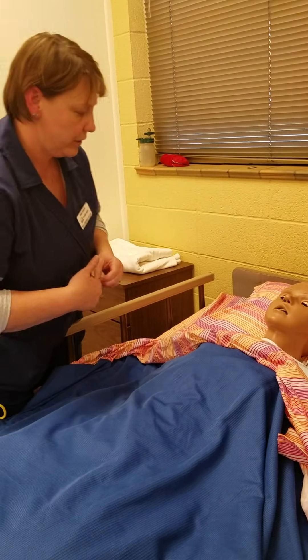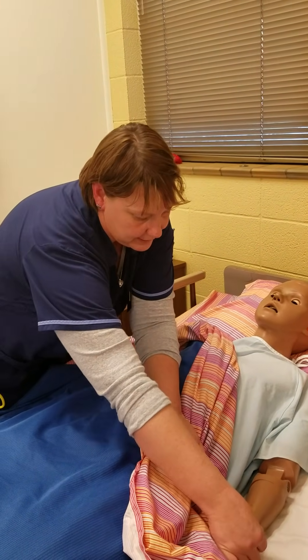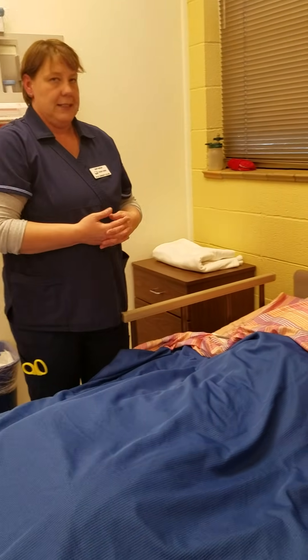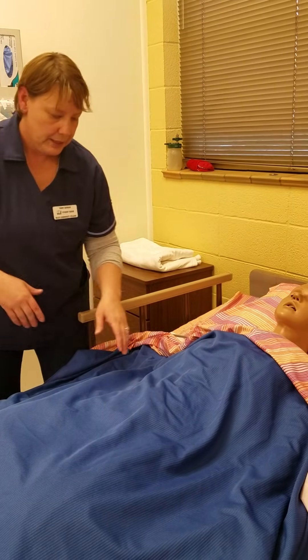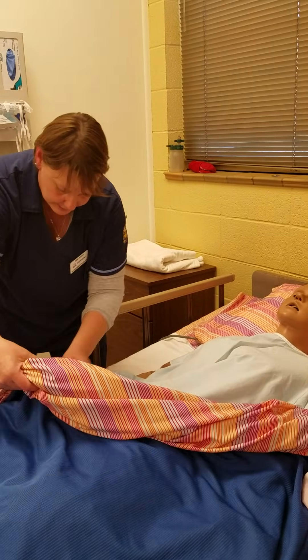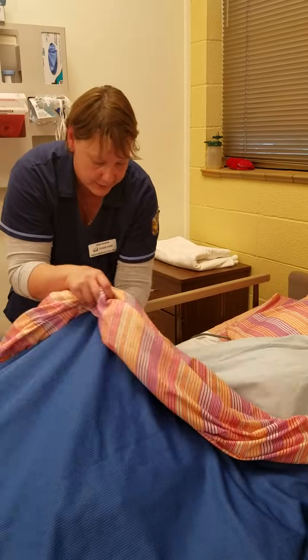Can you tell me what your name and date of birth is? He tells me that his name is Jose Cuervo and that his date of birth is 9/16/95, and I can verify that there. I also see that he doesn't have any allergies. I'm going to check his bladder and make sure everything's working okay, and also check the catheter site — it looks well and it's still taped down.